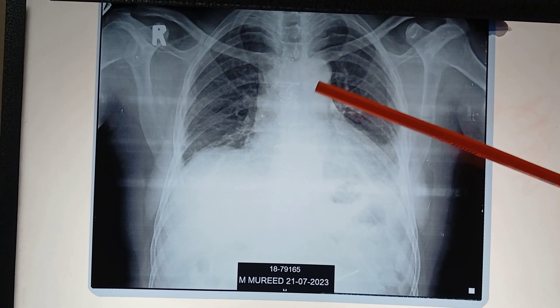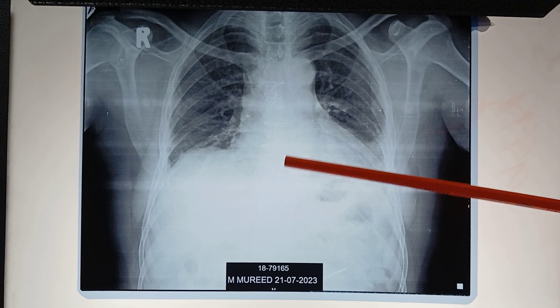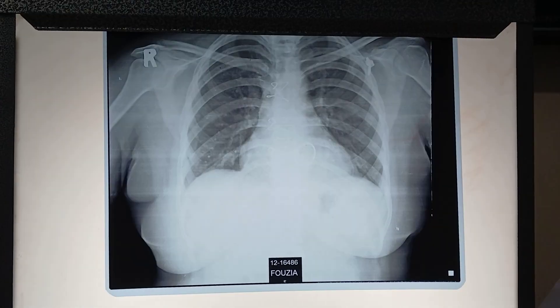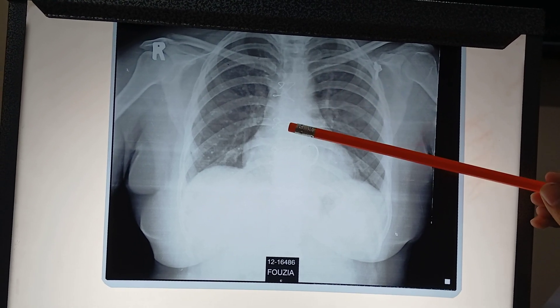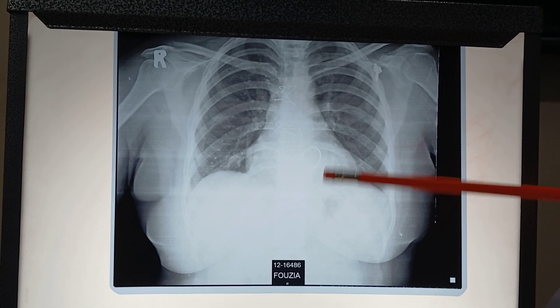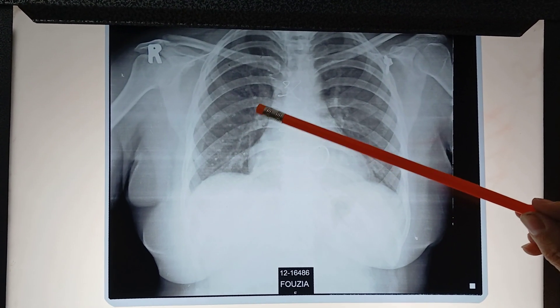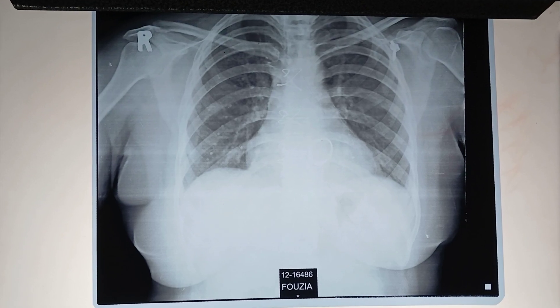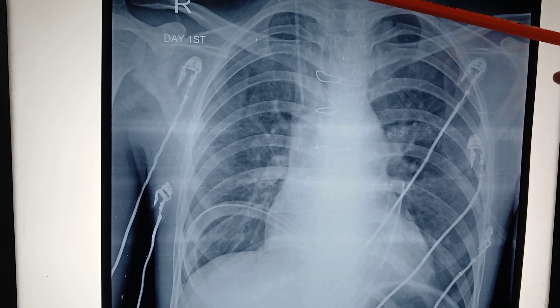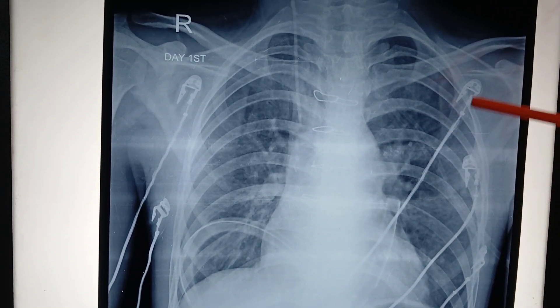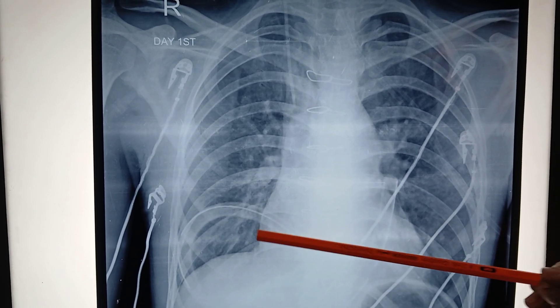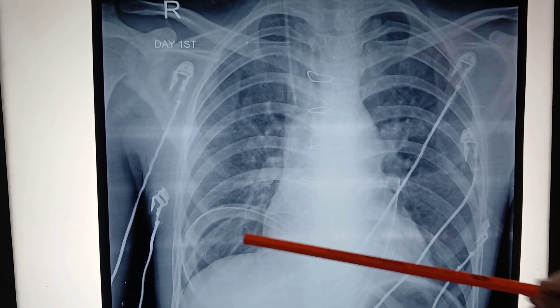This is a bedside case. As you see, sternotomy sutures are seen, so this patient is admitted in the ICU. This is another chest X-ray in which sternotomy sutures are seen, and this rounded opacity is the prosthetic mitral valve. These calcified nodules are likely granulomas. This is another chest X-ray on the first post-op day. This is the CVP line, these are the sternotomy sutures, ECG leads, and this is the drainage tube. These are inhomogeneous fibrotic bands in the right lower zone.